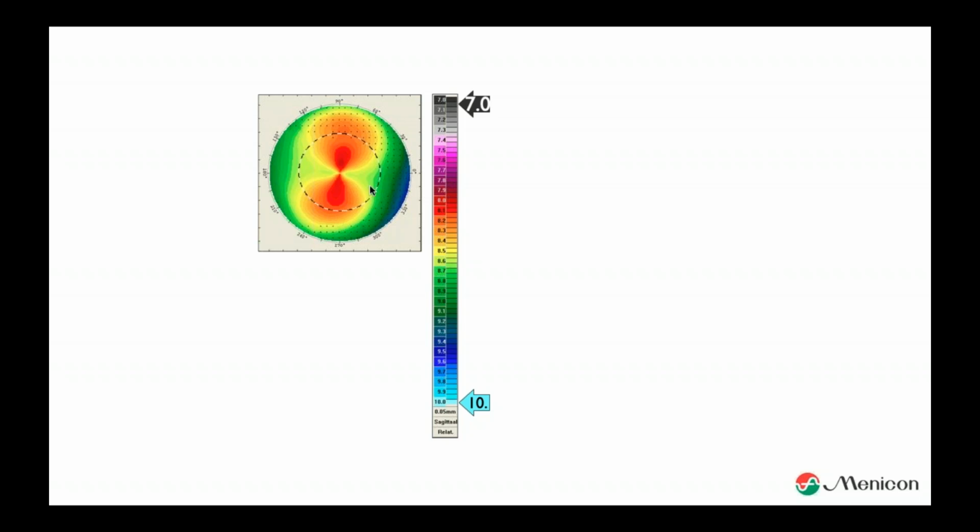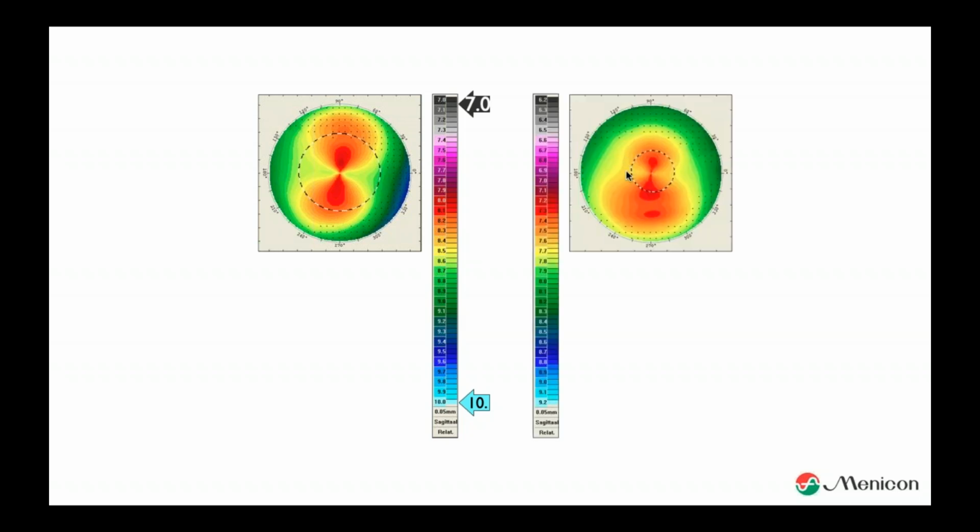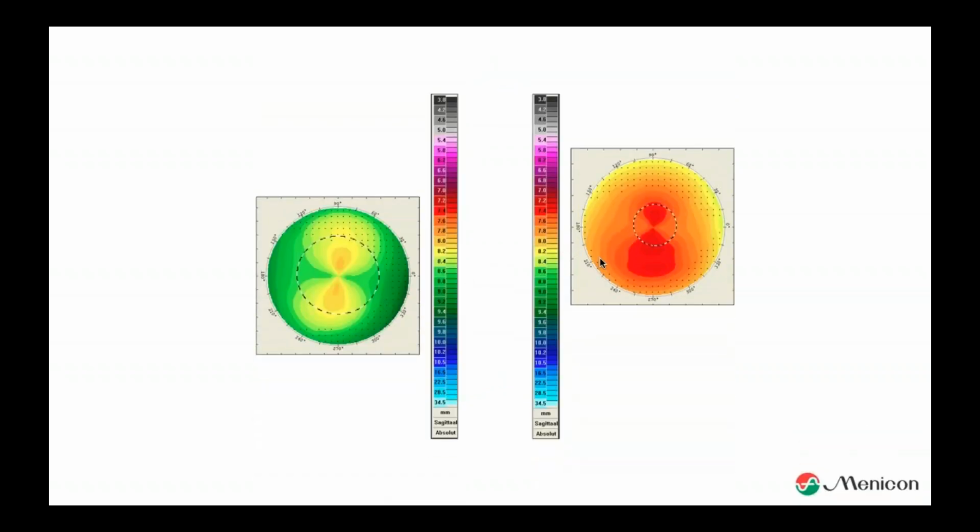Let me give you another example of exactly the same. This is a corneal astigmatism with the rule as well. The colors are in exactly the same order, but now the steepest part is 6.2 and the flattest part is 9.2. So what you will see is that the scaling is adjusting itself to the image. So interesting to understand is that when we leave the relative scaling and go to the absolute scaling, and I use exactly the same images, I only switch scaling, we end up with a totally different image.